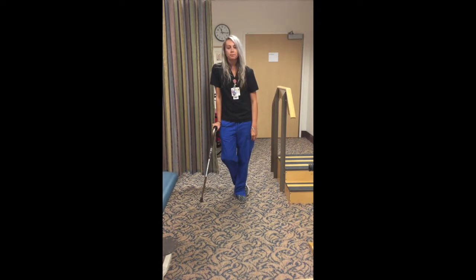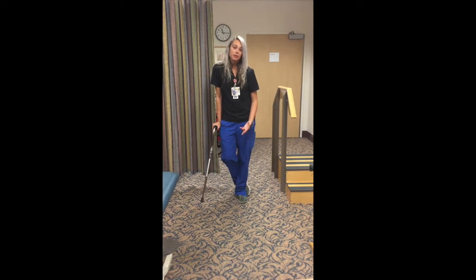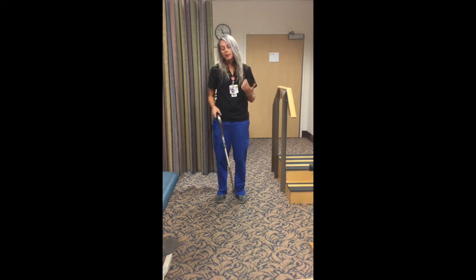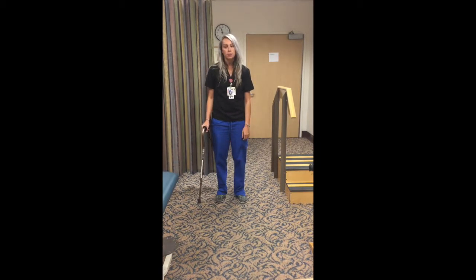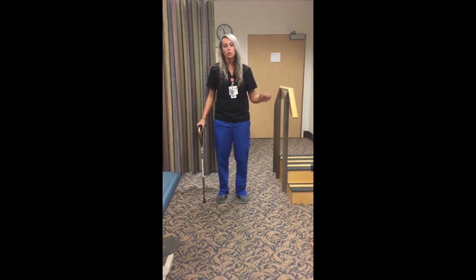And is this something they should practice at home, or is this something that they just do in the hospital? I mean, I think it's a great idea, especially with the cane, because for some people, being in the habit of using the cane in their non-dominant hand takes a lot longer than just a day or two in the hospital. So if you can get a cane prior to surgery, you can practice walking with it on the side that it's going to need to be held on for surgery, it makes that transition so much easier.